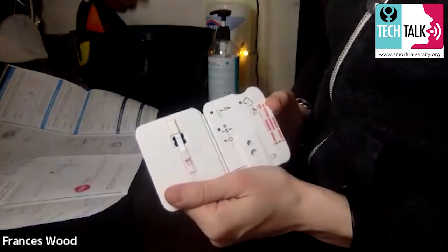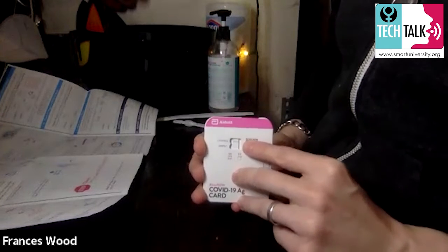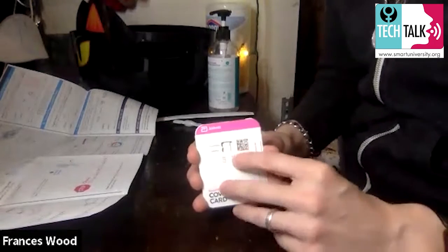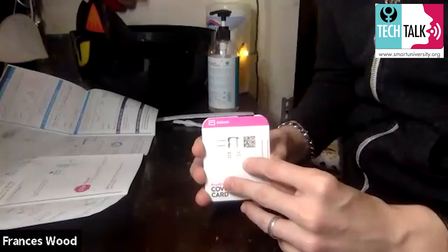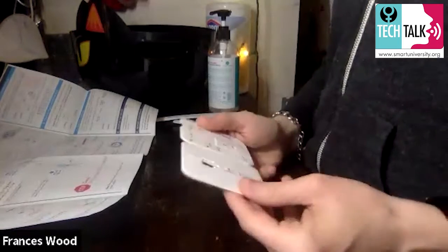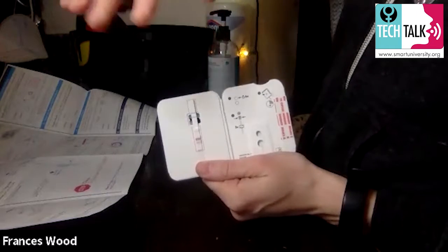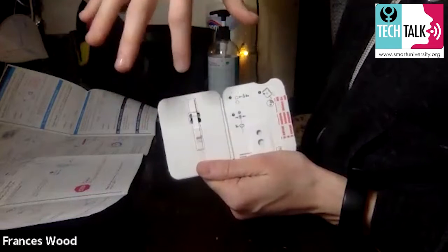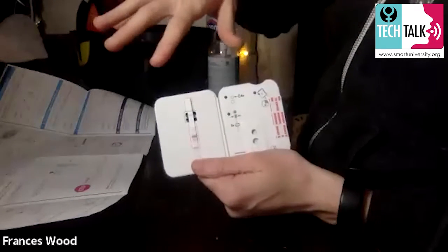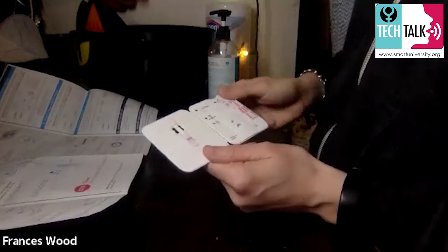I'm going to open the test card — there's a little place to tear it. When you open it, look for a blue line on the front. That's called your control line, and it means the test is functional. If you don't see that blue line, don't use this test — get another one. When you open it like a book, you'll see the blue control line in there too. Do not touch the area inside — that's where the testing fluid will travel. Touching it can mess up the test, so keep fingers, kids, and pets away.